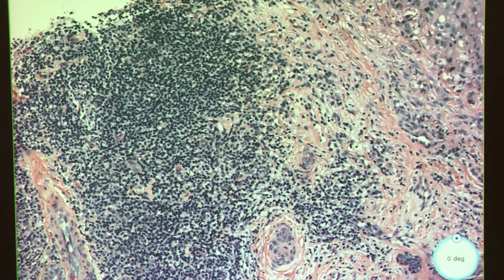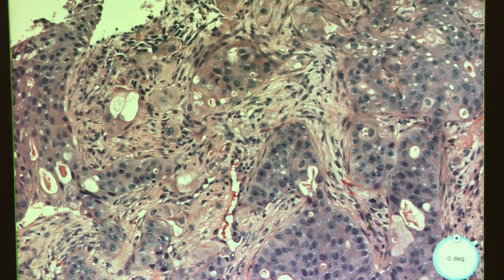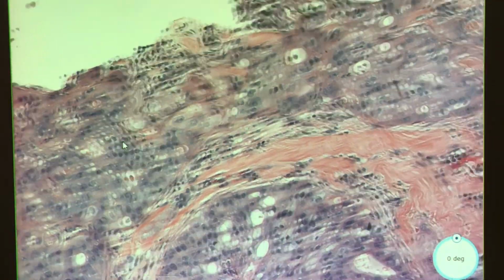Okay, and then this stuff that I was worried about, this just looks like lymphocytes. That love to confuse us even more. Yeah, that looks dyskeratotic, that looks dyskeratotic. Okay, I feel better saying like maybe this is more squamous.